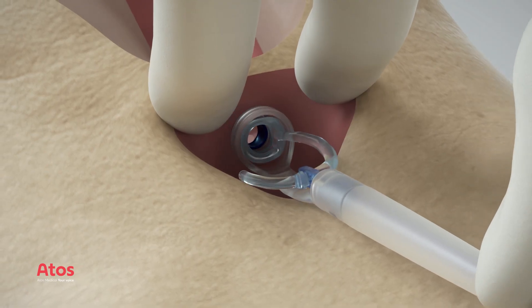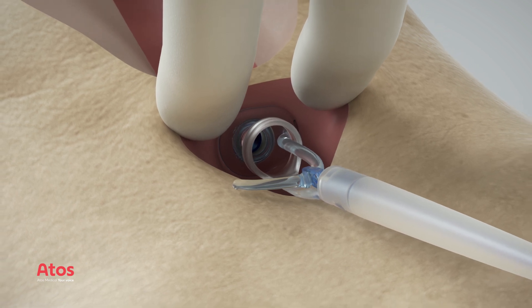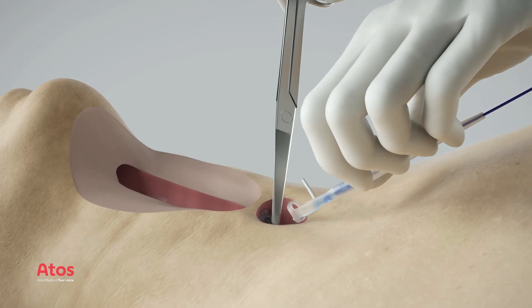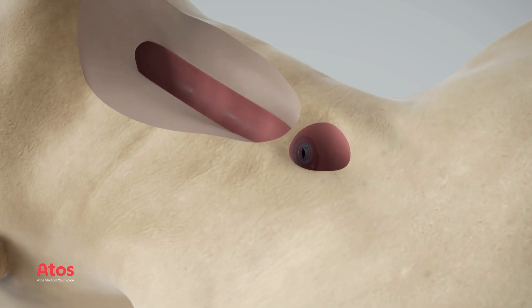Carefully pull the guide wire until the tracheal flange of the voice prosthesis is unfolded in the trachea by the dilator loop. Turn the prosthesis in the correct position and cut the safety strap. The primary placement of the voice prosthesis is complete.